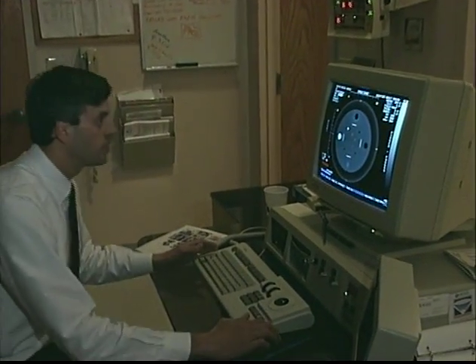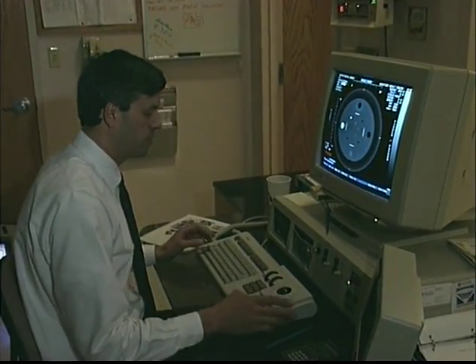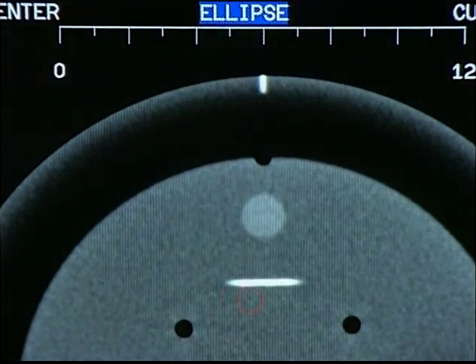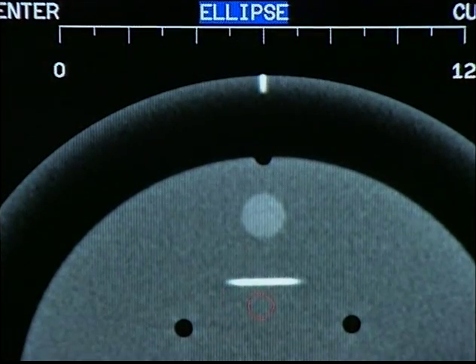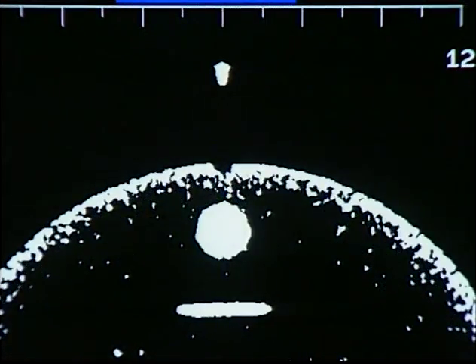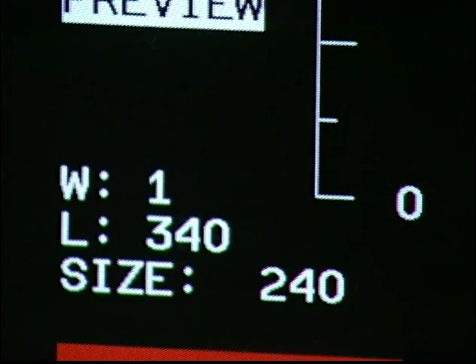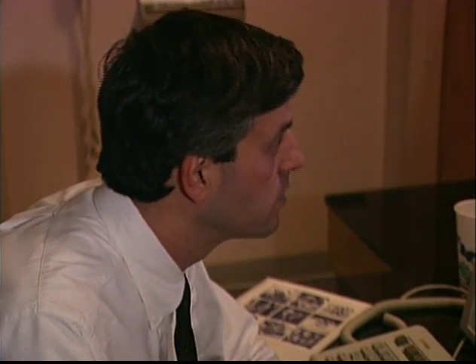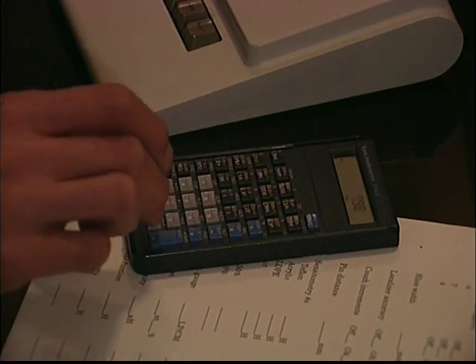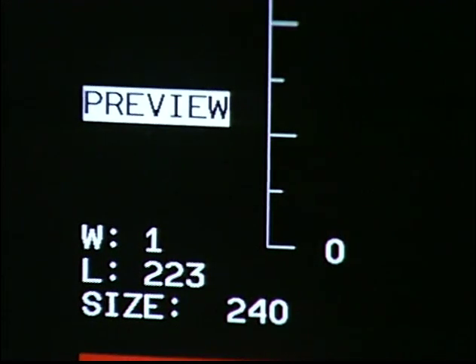To measure the Phantom slice width, we establish the full width at half maximum of the slice width ramps. For this calculation, we use the region of interest measurement to determine the background CT number and subtract it from the peak CT number, where the ramps disappear with the smallest window setting. We then divide this number by 2 to get the mean and add it to the background. Set the level at the full width at half maximum number.